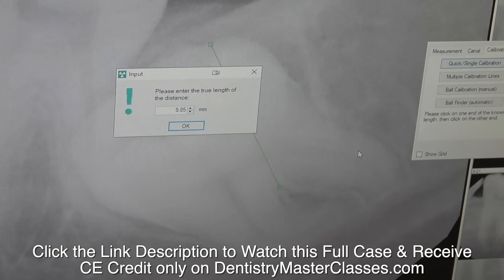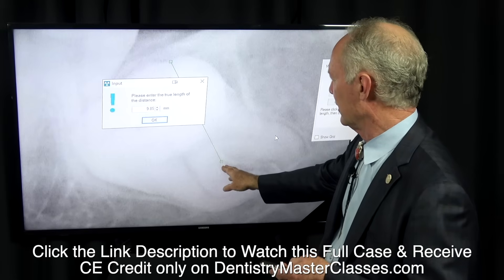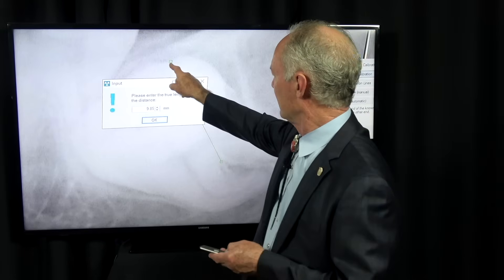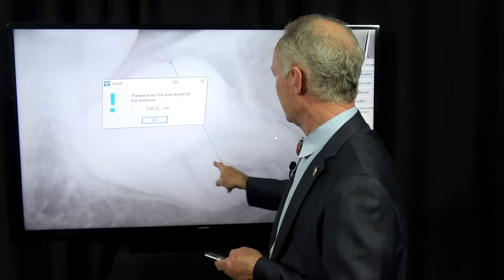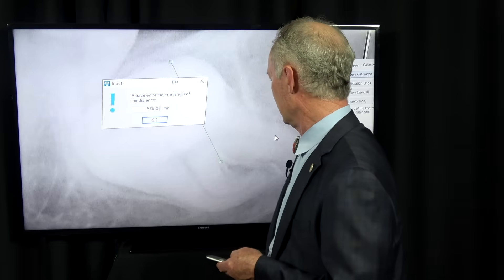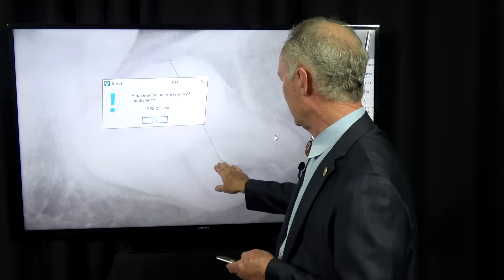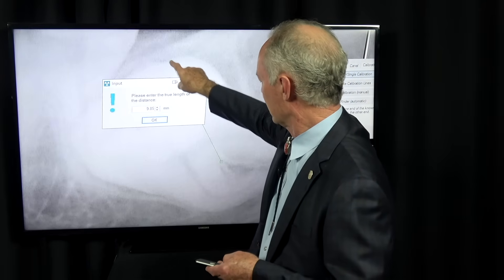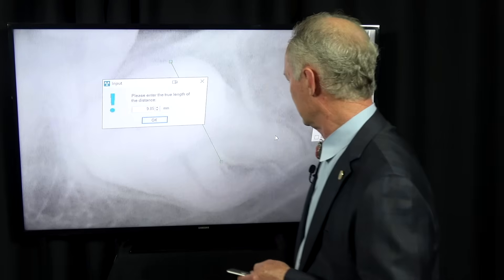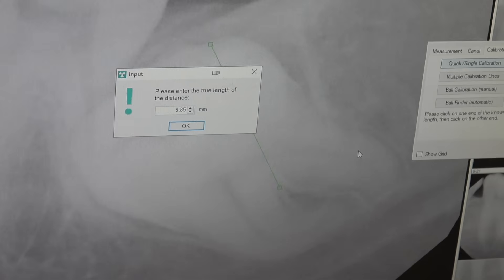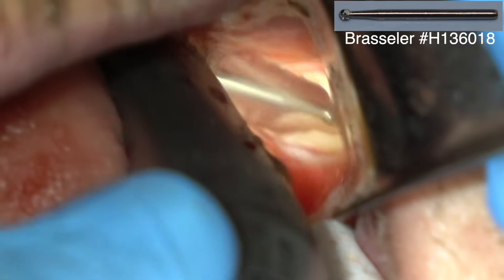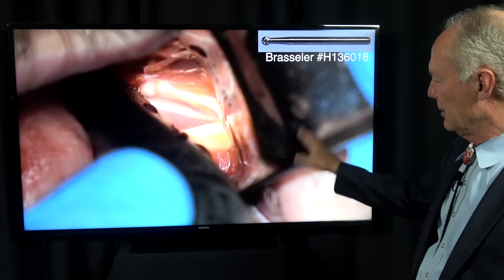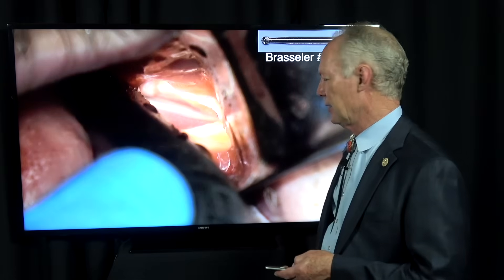I'm trying to section to the furcation. From the coronal part of the tooth to the furcation is about 10 millimeters. So I know I don't want to go more than 10 millimeters from the coronal to the furcation, because you don't want to take any chance of damaging that inferior alveolar nerve.